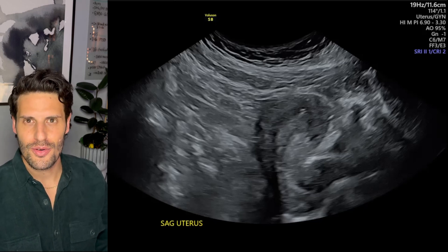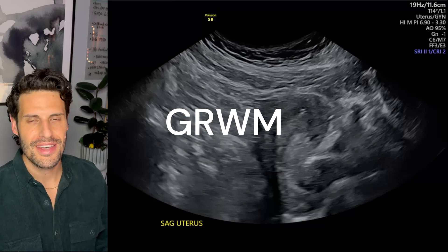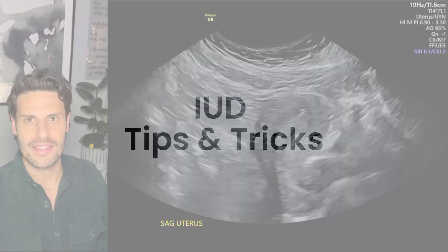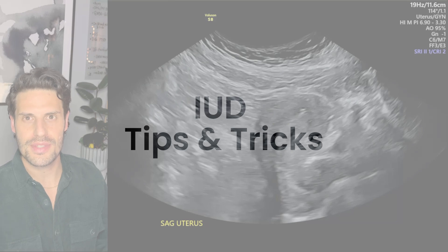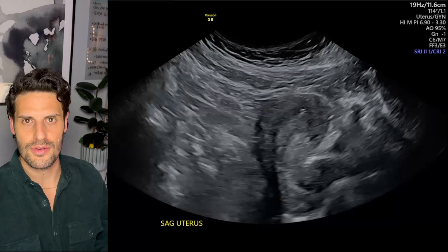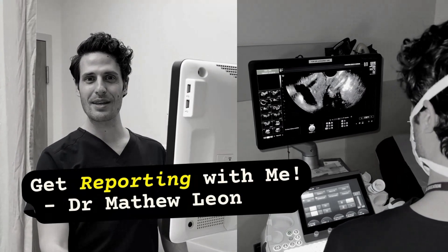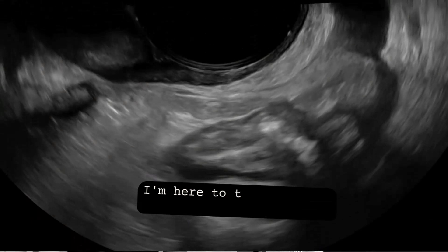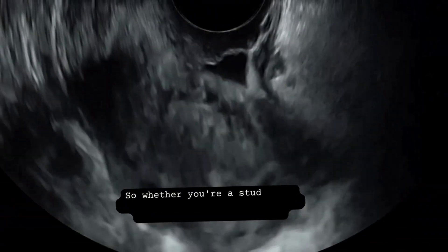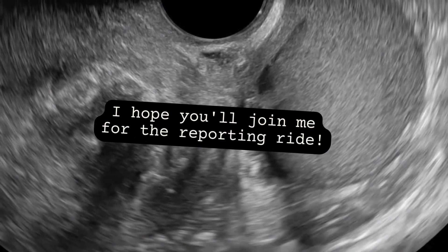Hello! Here we go for another episode of GRWM — Get Reporting With Me. We're going to focus today on an IUD, intrauterine device, with tips and tricks on how to characterize IUD position on ultrasound. Is the IUD correctly positioned or incorrectly positioned? I'm Dr. Matthew Leonardi, here to teach you how to interpret ultrasound, covering everything from basics to advanced techniques.